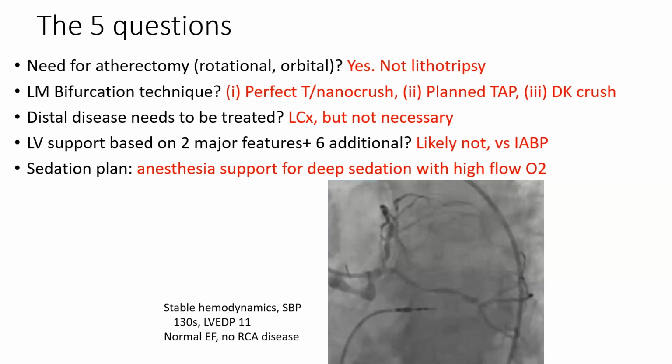Also, lithotripsy, in my experience, is less tolerated hemodynamically than rotablation because you have to inflate that balloon multiple times for 10 seconds each time. So it may be less tolerated than short runs of rotablation.